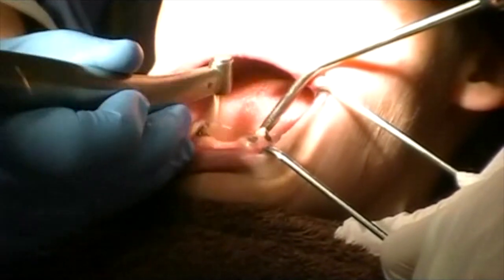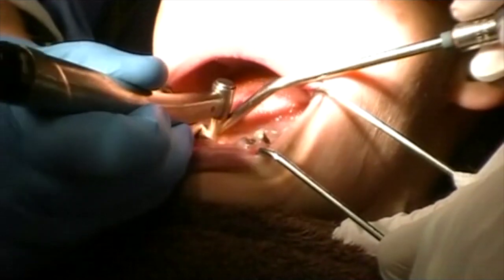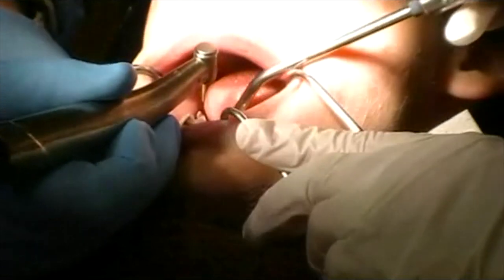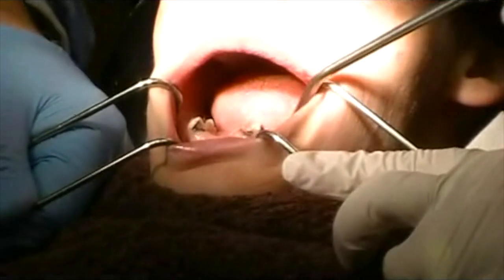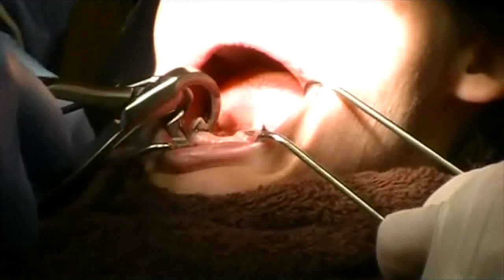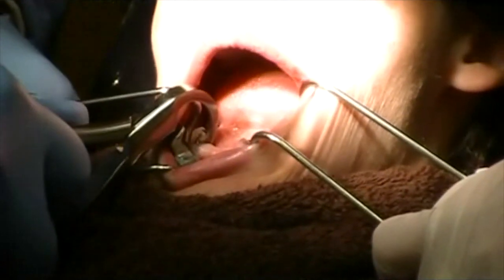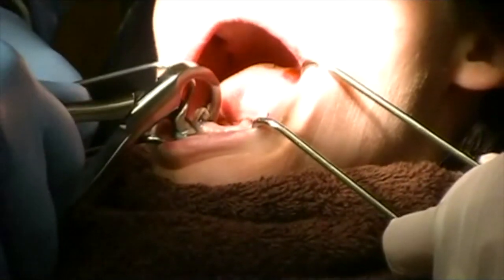We have a couple of really barely decayed teeth here. Same process where we're getting as far back as possible. Now if you can lift your chin up a little bit for me — good — and a little bit more.